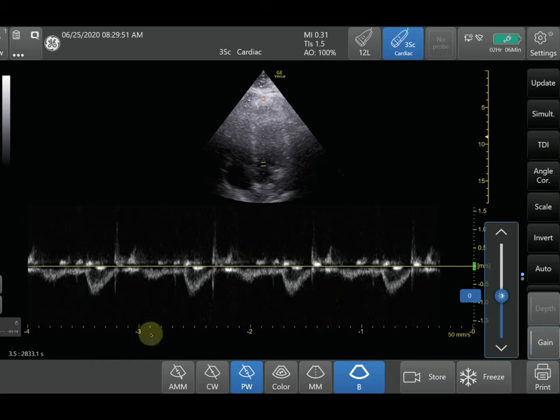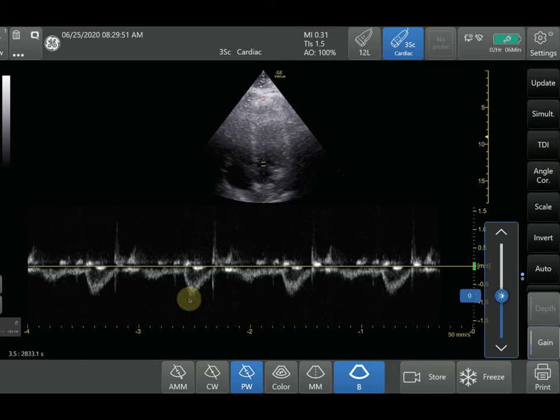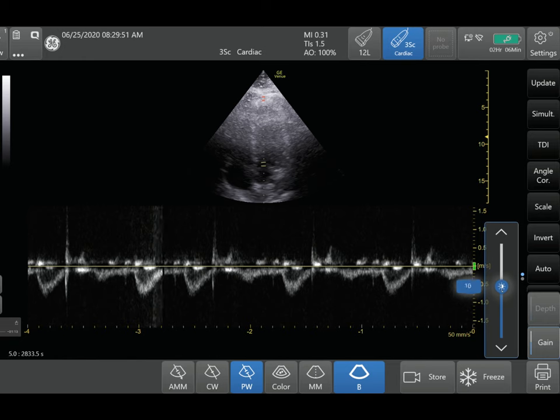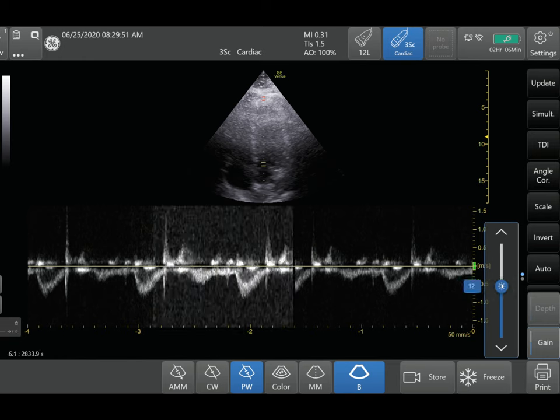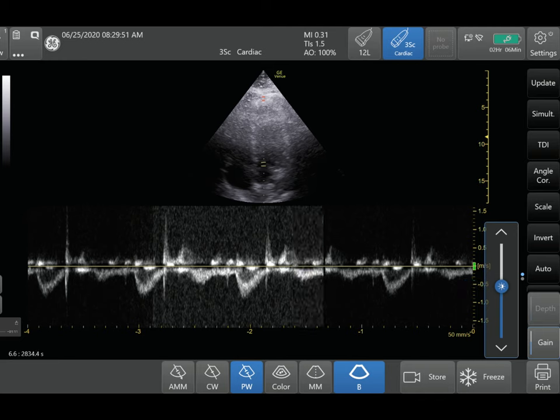After you push Pulse Wave Doppler and get the tracing, the first thing I adjust is the gain — because sometimes you might be missing signals if you don't optimize it. Here I'm increasing the gain a little bit, and you can see how that clears up the tracing.